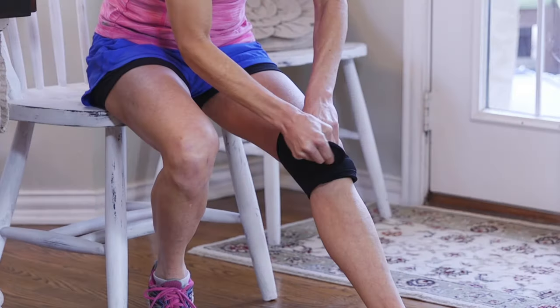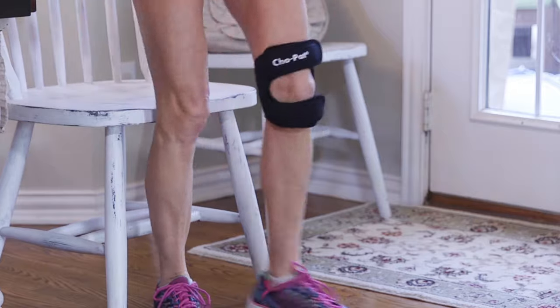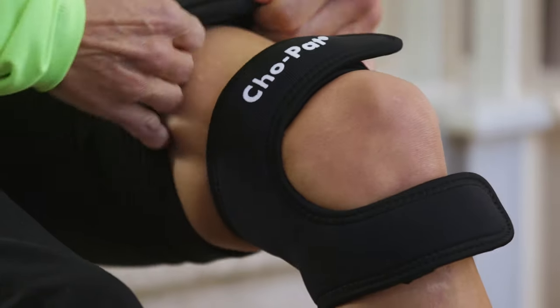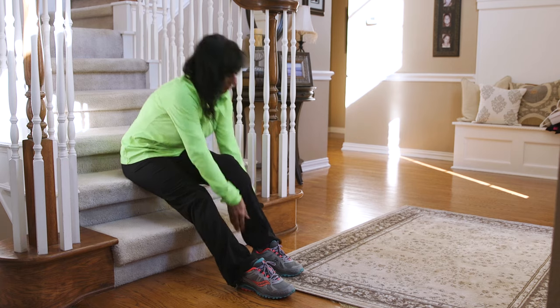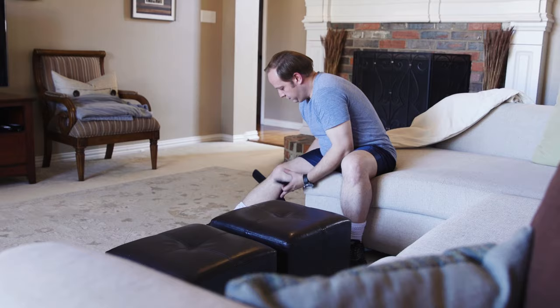The CHO-PAT Dual Action Knee Strap provides a unique dimension of relief for those suffering from a wide range of knee conditions, including runner's knee, jumper's knee, IT band syndrome, meniscus tears, patellar tendonitis, and weak and arthritic knees.